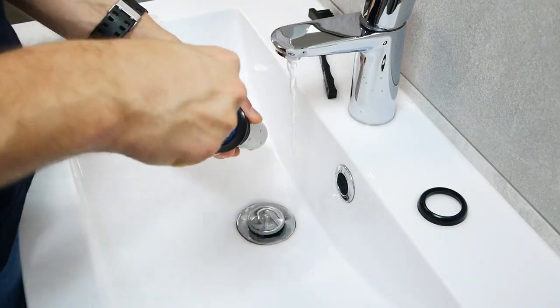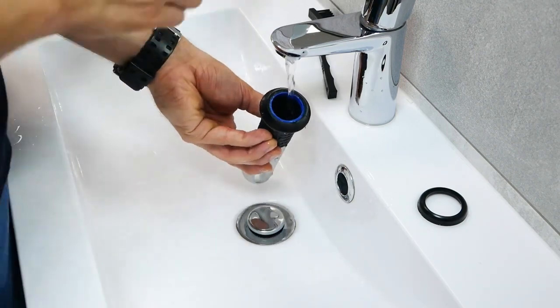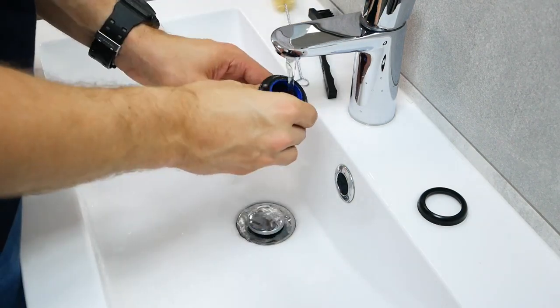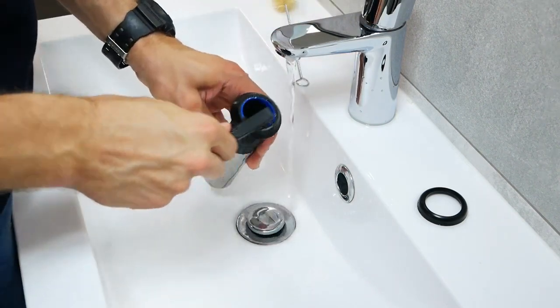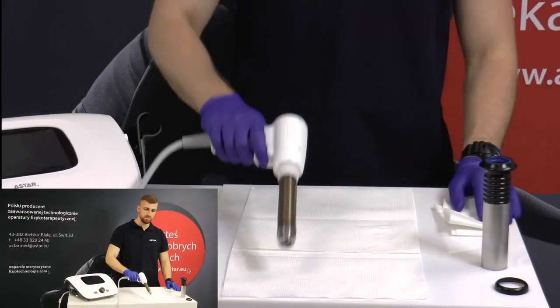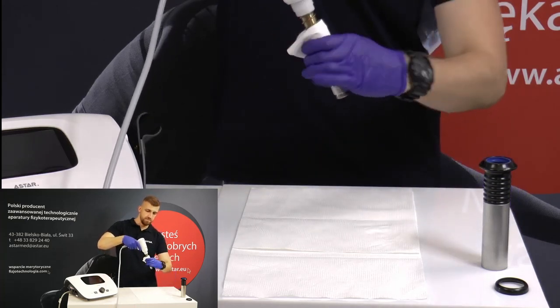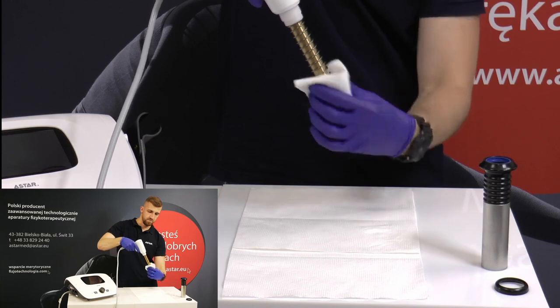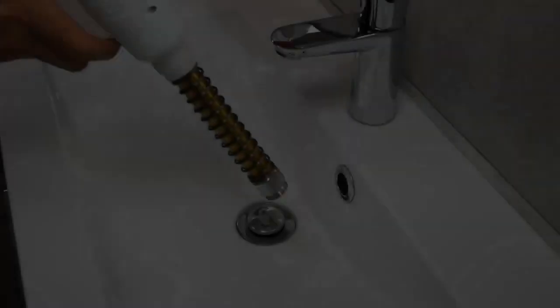If necessary, you may use the round brush which is included in the kit. Don't forget to clean the slit next to the blue gasket. Wipe dry the projectile system, including the spring and the front, to remove any traces of moisture or impurities. The projectile system should be completely dry.